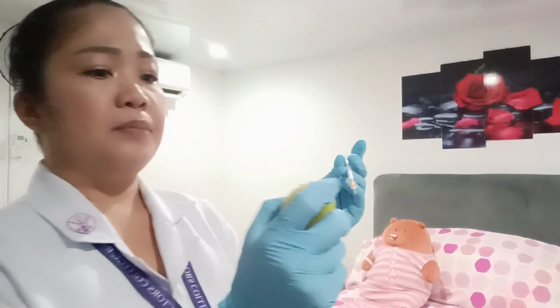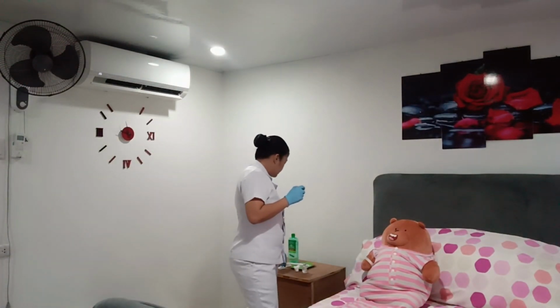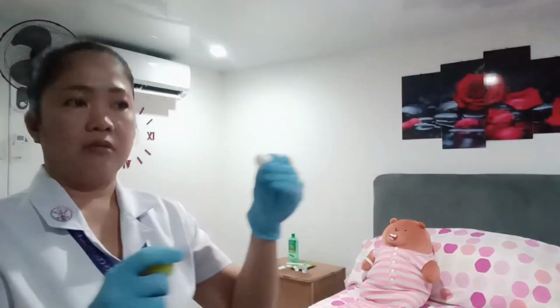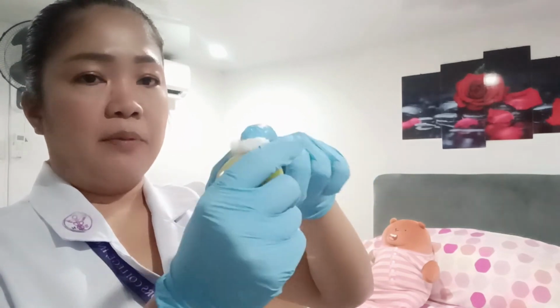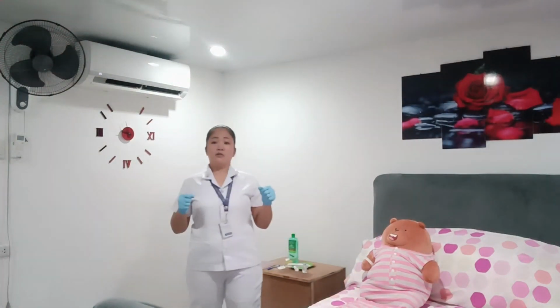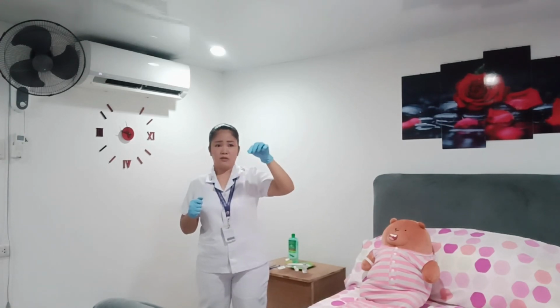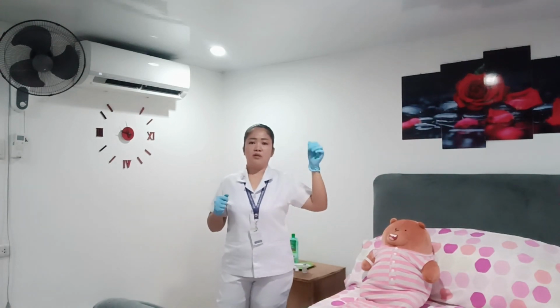Now, if there is blood coming out, all you have to do is give some pressure, not too much, just enough to stop the blood. And then you could cover this with a band-aid. Take note, do not massage the area. You cannot shake it or massage it. If you see blood, put a dry cotton, and then cover it with a bandage, and eventually it will stop.